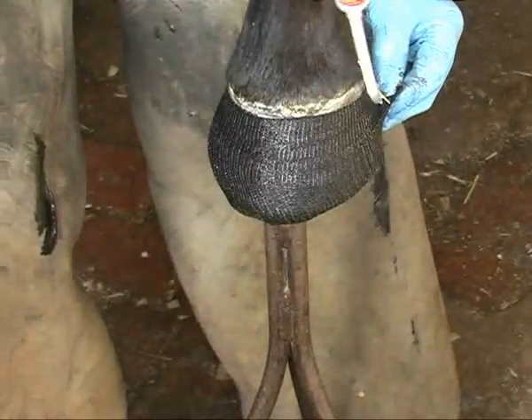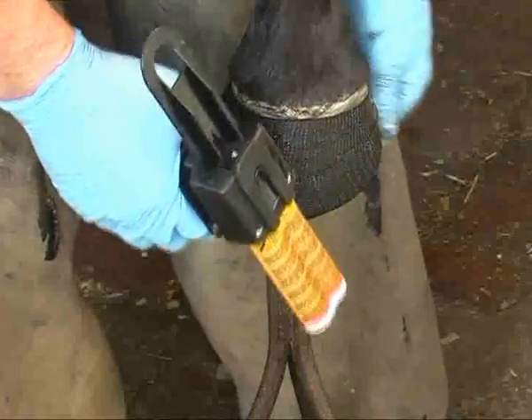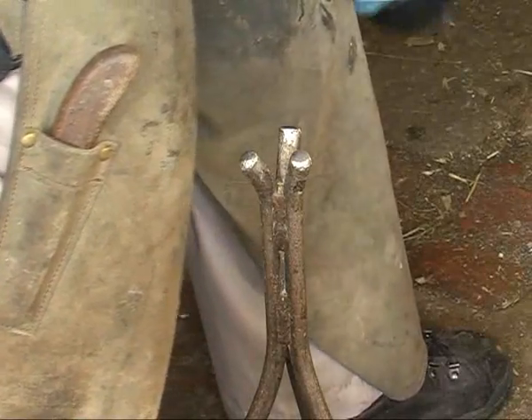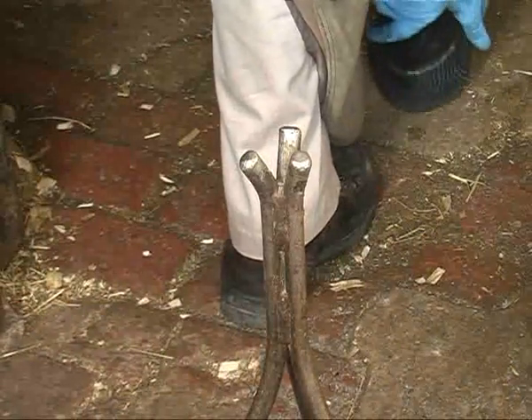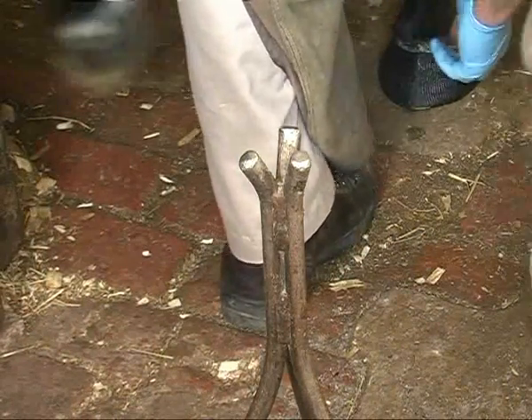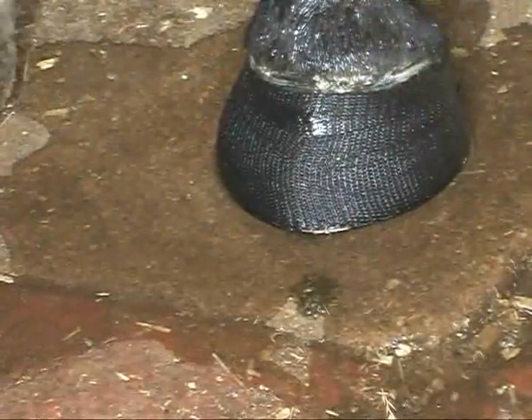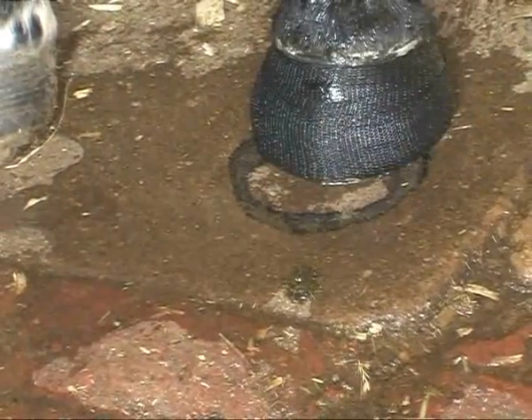We'll put a little drop of this underneath. I want to try and get it to stand on that level bit of concrete, because underneath the surface it's got to be configured fairly flat, as we're going to nail the shoe to it in a few seconds. We'll just tip a little bit of water on this foot — on the cuff. That's the catalyst; the water is what makes this product go off hard. Between four and six minutes now, that'll be hard enough to put the shoe on.